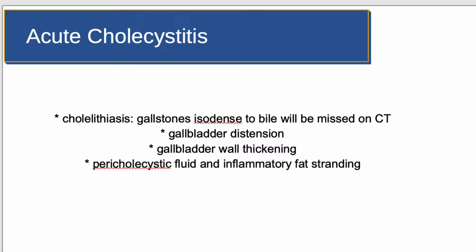Four useful signs to look for on CT for the diagnosis of cholecystitis include: 1. The presence of gallstones, also known as cholelithiasis. It is important to note that gallstones isodense to bile will be missed on CT — in these instances ultrasound is invaluable. 2. Distention of the gallbladder. 3. Gallbladder wall thickening. 4. Pericholecystic fluid and inflammatory fat stranding related to the gallbladder.